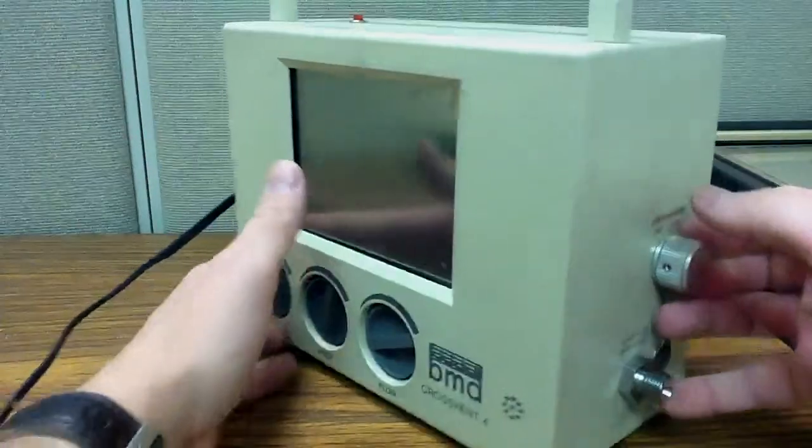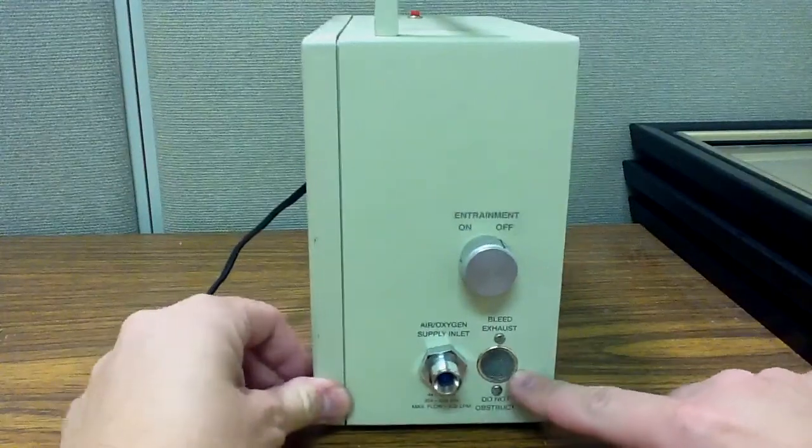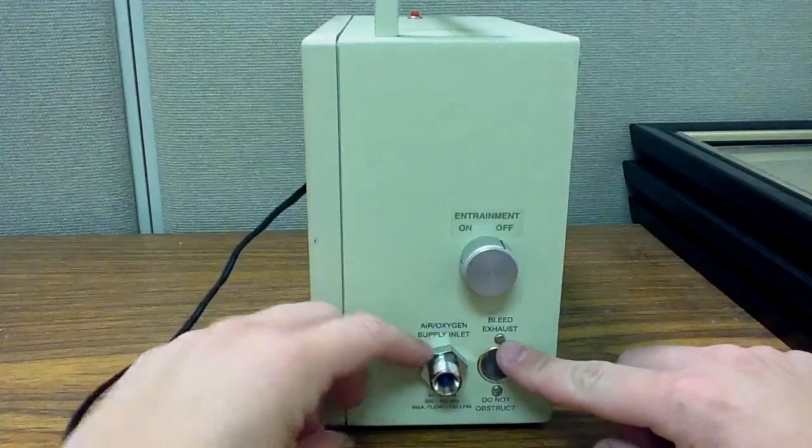Okay, let's take a look at the right side of the ventilator. This is my bleed exhaust. If I have a little too much gas, it'll bleed off from here.